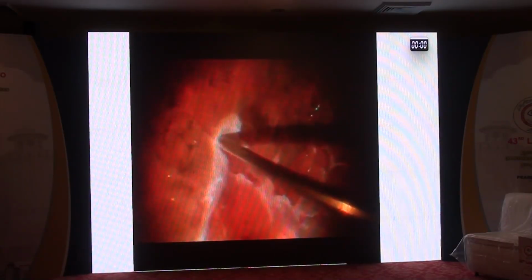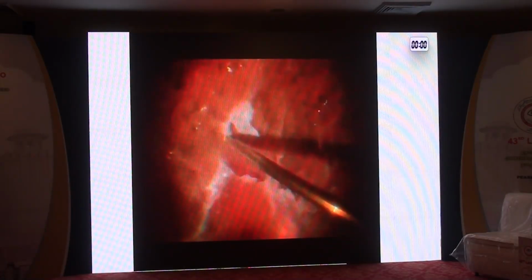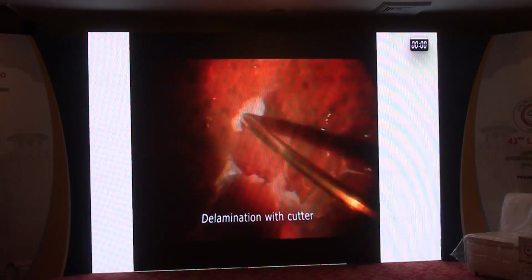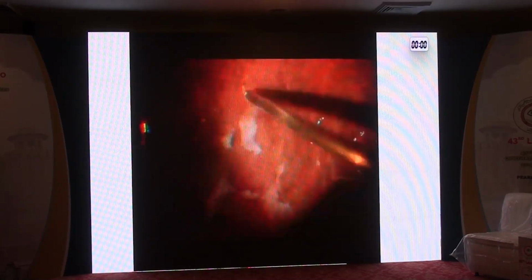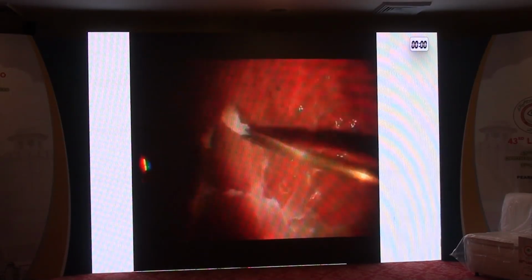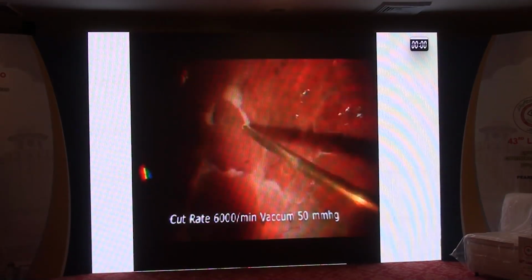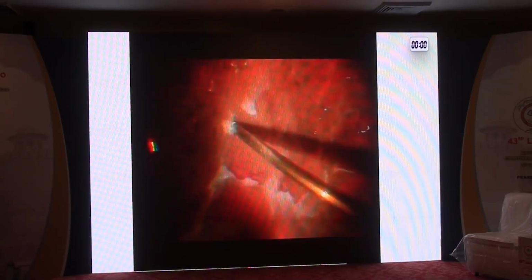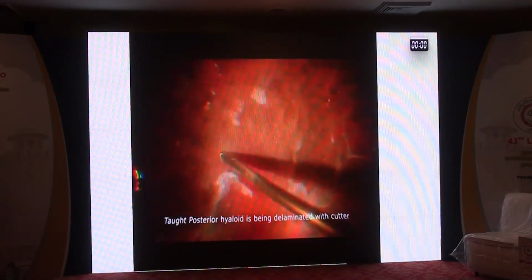Delaminating and segmenting with the cutter at a cut rate of 5,000 to 6,000 and a vacuum of 50 to 100 millimeters of mercury gives good segmentation and delamination, and a good postoperative result. I do end up using MaxGrip forceps and gripping forceps just to localize the spaces where I have to use the cutter.